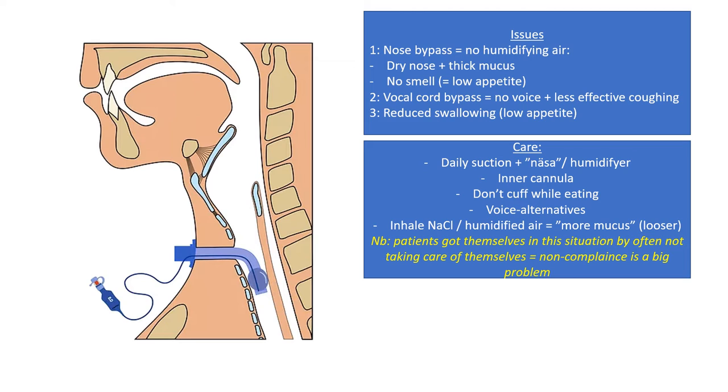you need to do some care so that you don't obstruct with mucus. And one of the things is that you need to suck daily. You suck through this: you remove the inner cannula, and then you suck in this channel, the outer cannula. You use your humidifier when you can, and you have this inner cannula in. You can use it without the inner cannula as well, but the inner cannula will help somewhat with the mucus.